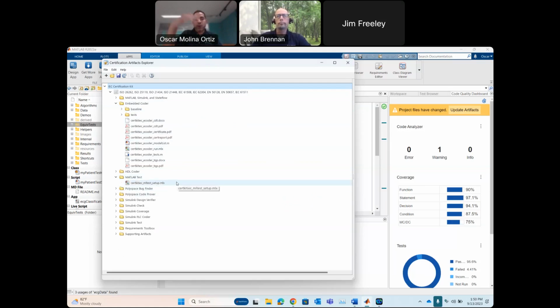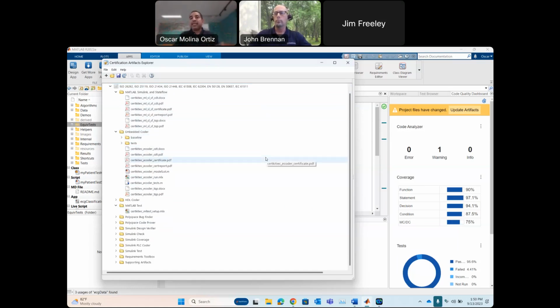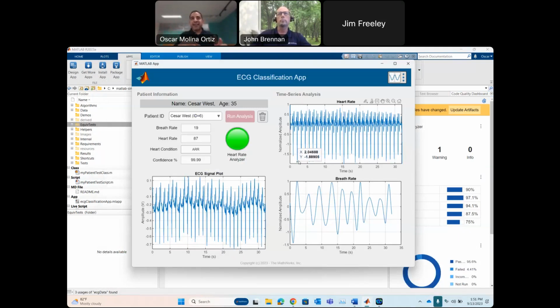So we have a live stream that will show you a step-by-step process by which you can certify MATLAB Test. So all of this information is available for you, because we want to make it easy for you to use our tools, not to be concerned about how you actually certify MATLAB Test, because we have already gone through that pain, but it's more about you focusing on how to make or certify the function that you are working on. So this is all I have to show about this seemingly easy to use app.